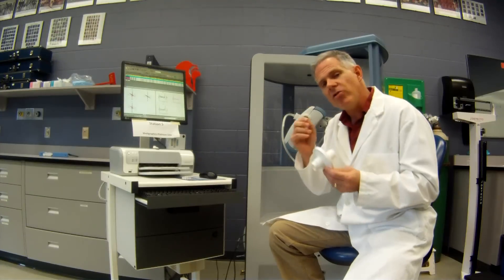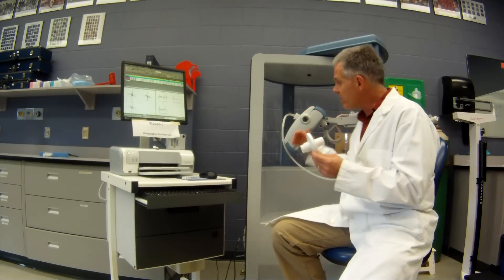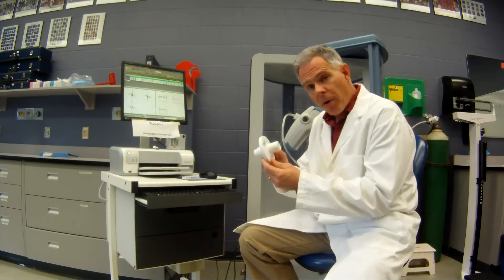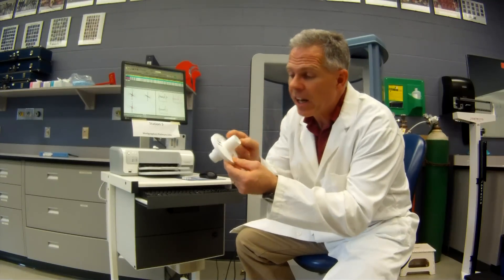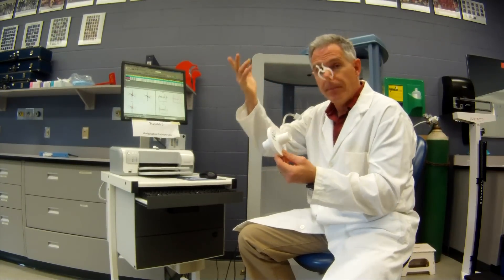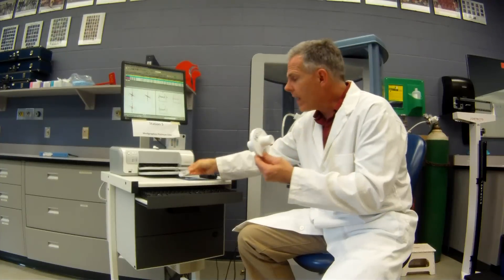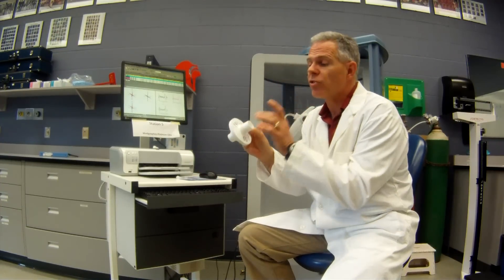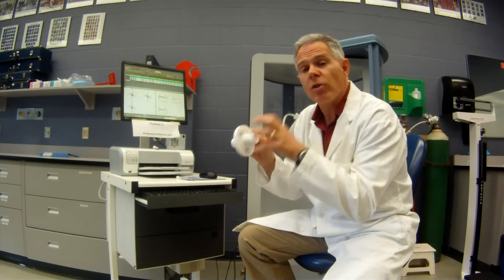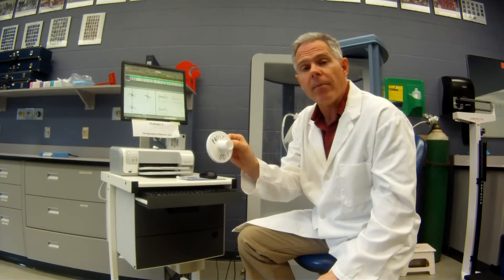The key things that the patient has to be able to do during this test, while the door is closed, is that like with all pulmonary function testing, they need to get a good seal around the mouthpiece. They're going to be wearing nose clips. Make sure all the air that they're breathing goes in and out through here unobstructed. It's important that their tongue or their teeth are out of the way - teeth should be on the outside with their lips getting a good seal around the filter.